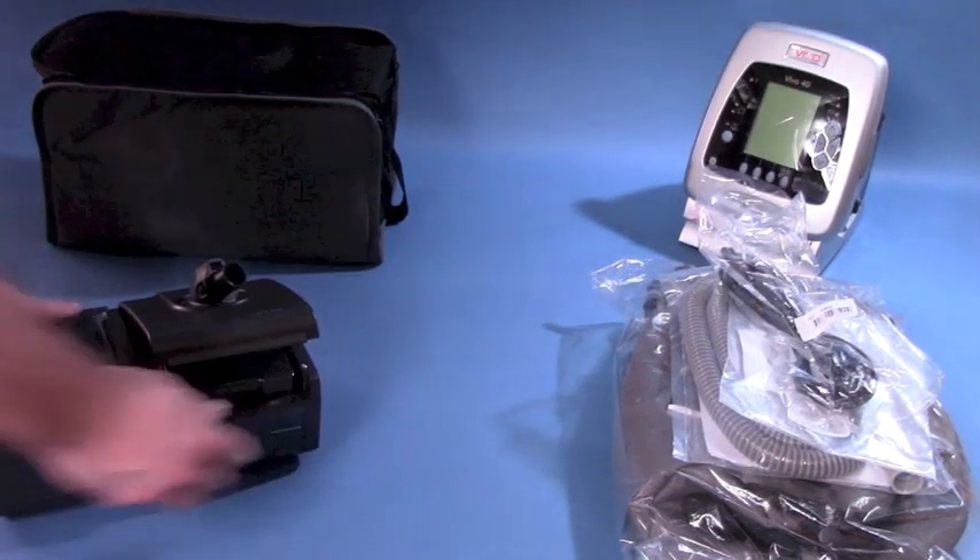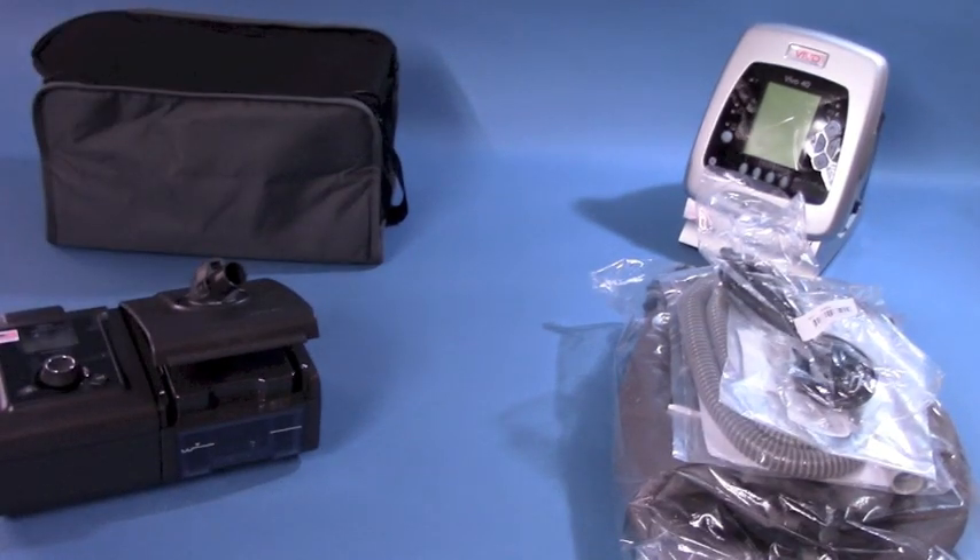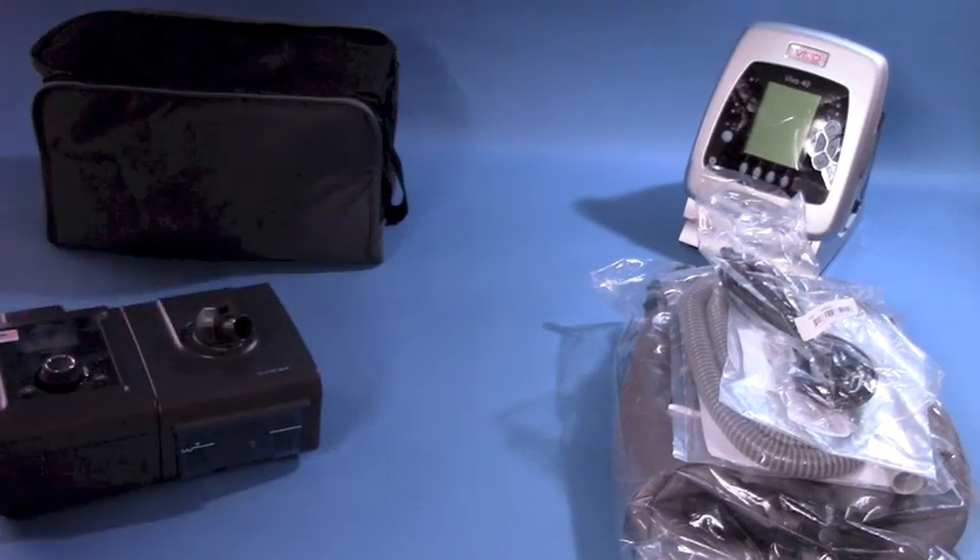The System 1 Integrated Humidification allows you to get the most out of your System 1 Advanced BiPAP ST C-Series machine. Eliminate dry mouth and nasal passages and enjoy easier breathing with the DS-1060 TS BiPAP ST.